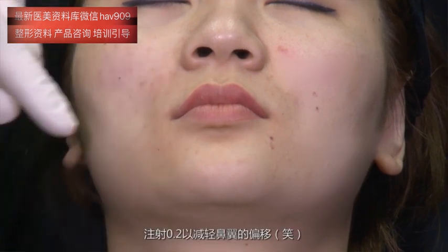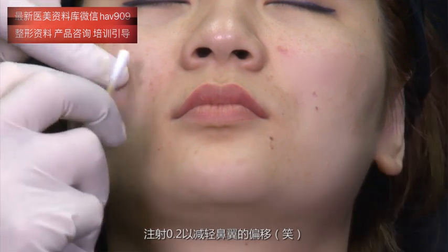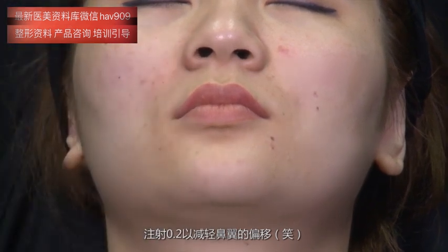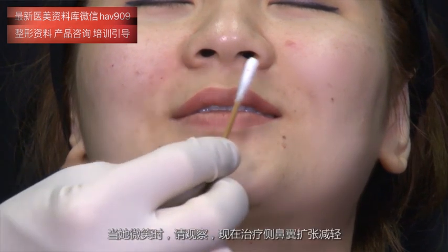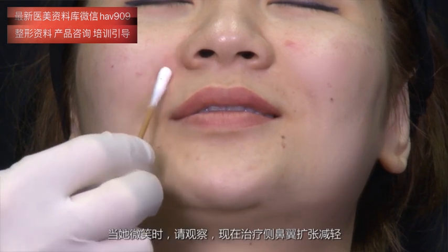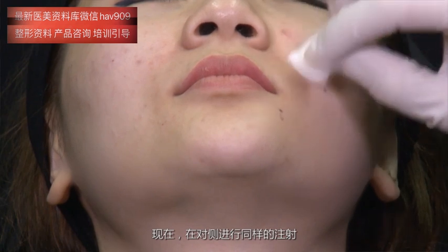I injected 0.2 to reduce the excursion of the nasal flare. Smile. When she smiles, please observe that now the treated side has less widening of the nasal flare. Now let's do the same on the contralateral side.